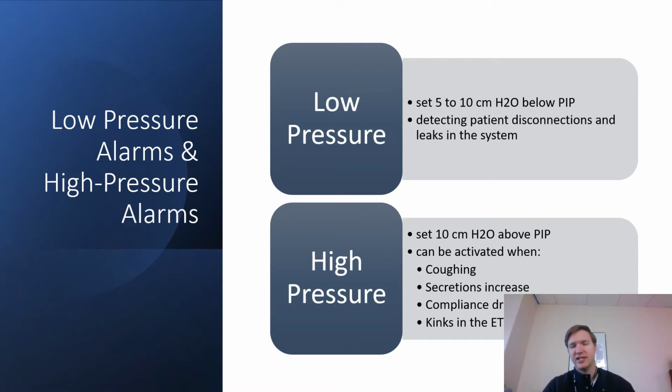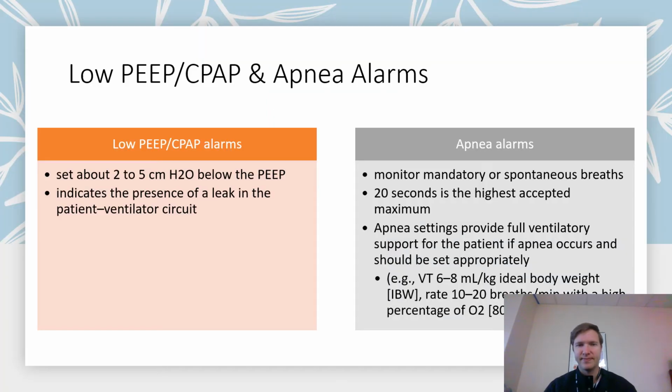Obviously, once you're done, you're going to take it back down. So that's something to be aware of. And if you don't change it during that procedure, then you need to be very cognizant of looking for signs of hypoxemia and hypoventilation very soon, right, as well, if you don't change that.